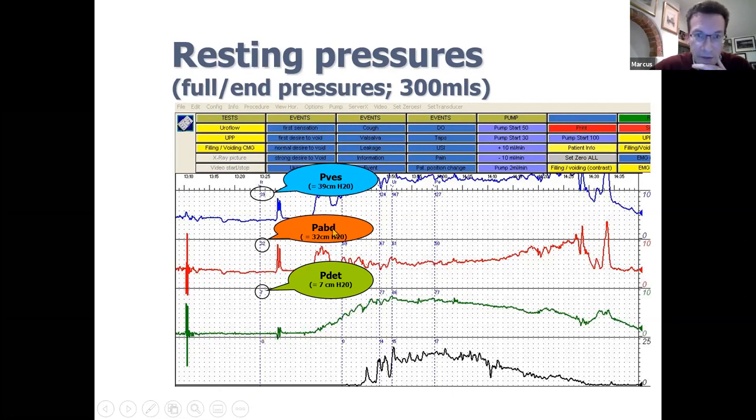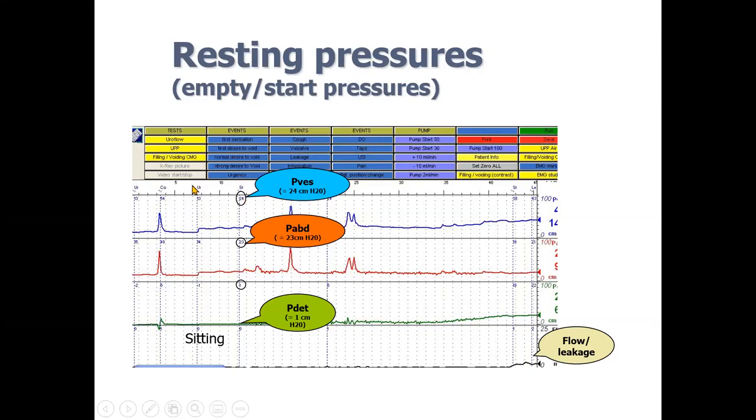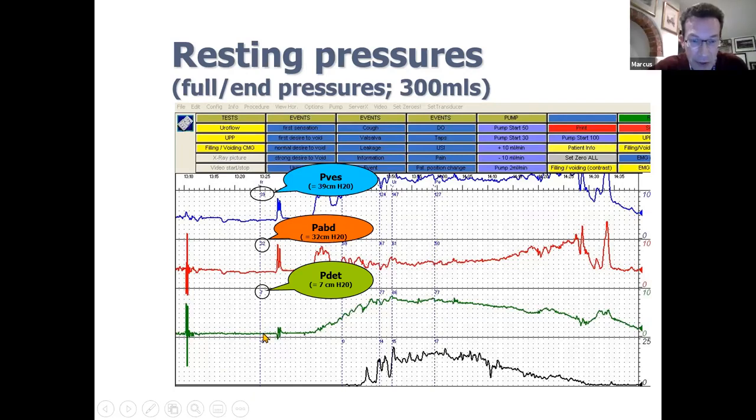This is obviously the voiding phase. I've had to explain that this is permission to void preceding this point. So I'm not sure if your uncertainty is because at this point you're seeing detrusor overactivity. Yes. So it's probably that it's plotted at a much broader time scale than you're used to seeing. You don't normally see an entire screen occupied by only 40 seconds of trace. If you compress that into the more compressed time scale that you're used to looking at, this would look like detrusor overactivity. So I think you're being a bit misled by the time scale. You're thinking that looks like poor compliance, but actually this is detrusor overactivity at a broad time scale. So when you look at this, you're probably much happier when you see it that way.